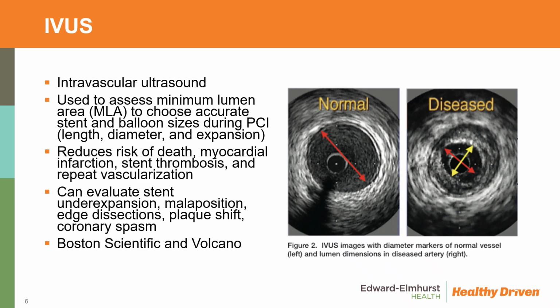And we have two types of IVUS here. We use Boston Scientific and Volcano. There are other options as well, but those are the ones that we are using.